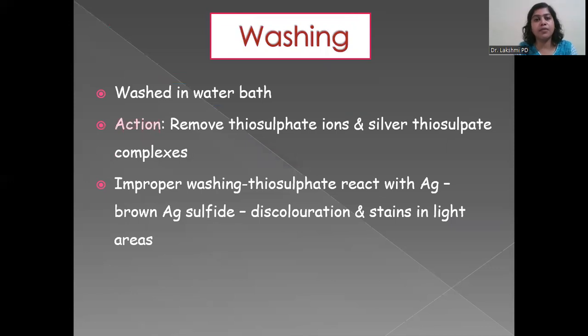The last step, again, like between your developing and fixing, you have a rinsing. Here, it's called washing, because it's not just rinsing, it's completely washing away any amount of developer as well as fixing solution. So it is washed preferably in running tap water, just to remove any trace amounts of thiosulfate ions and silver thiosulfate complexes, which if not removed can lead to the formation of brown colored stains over a longer period.